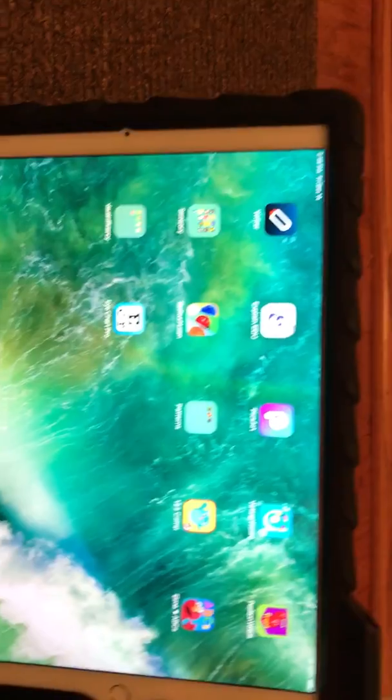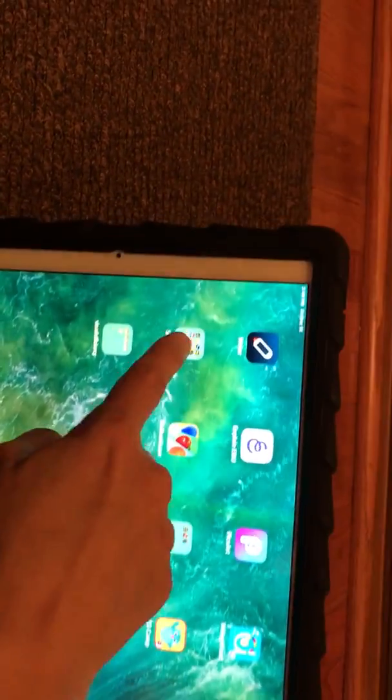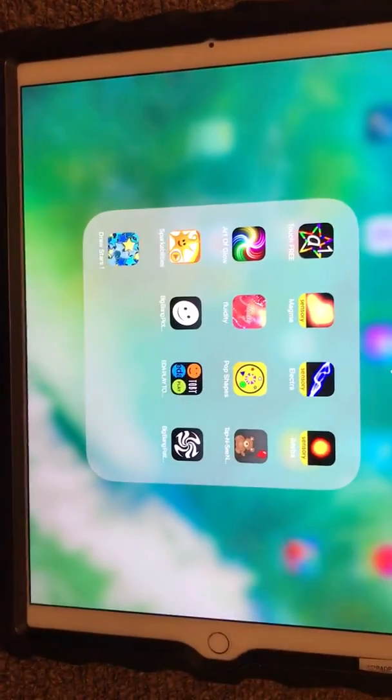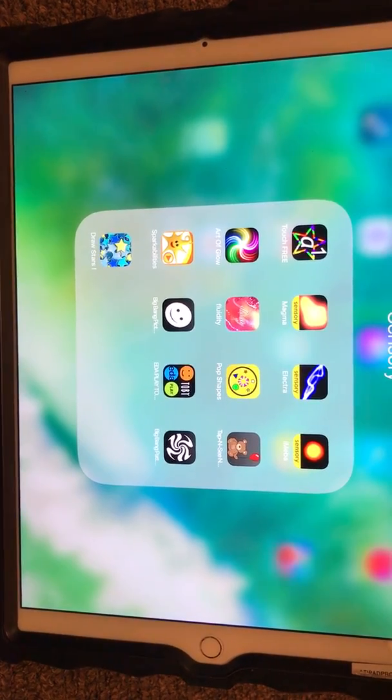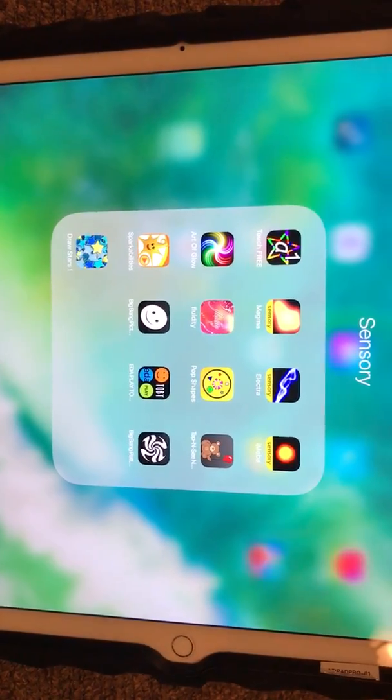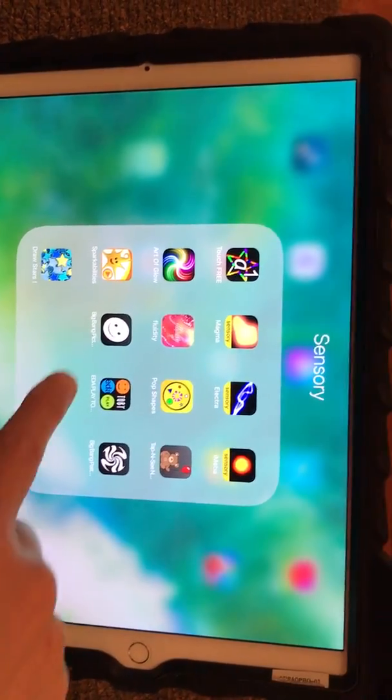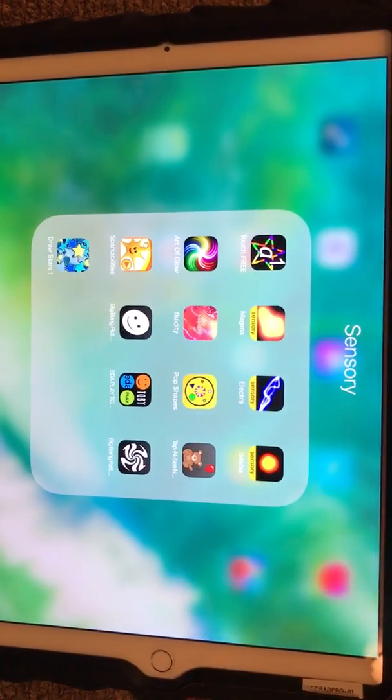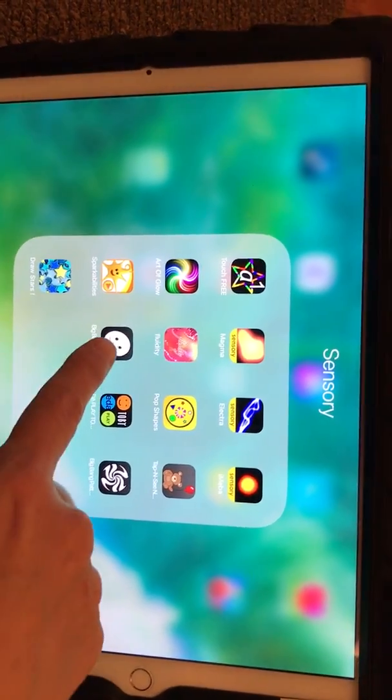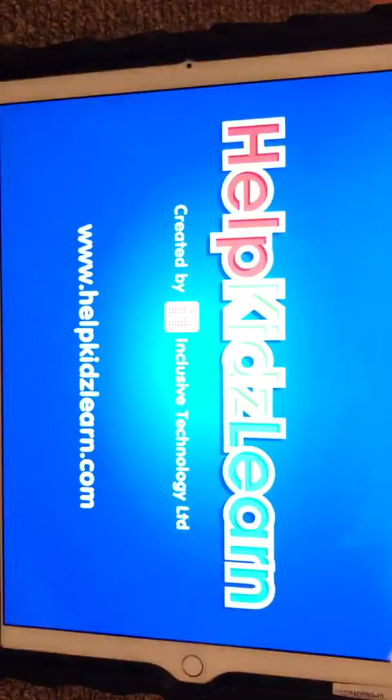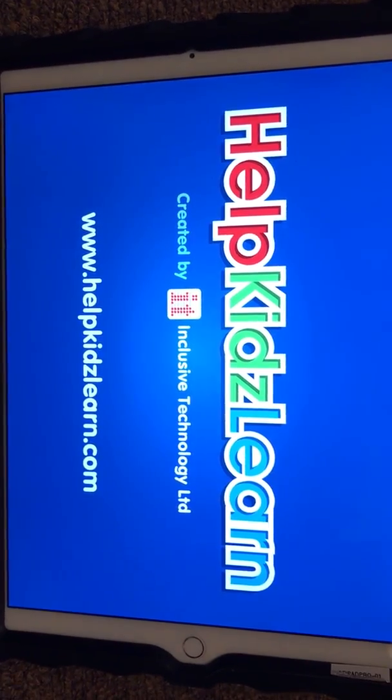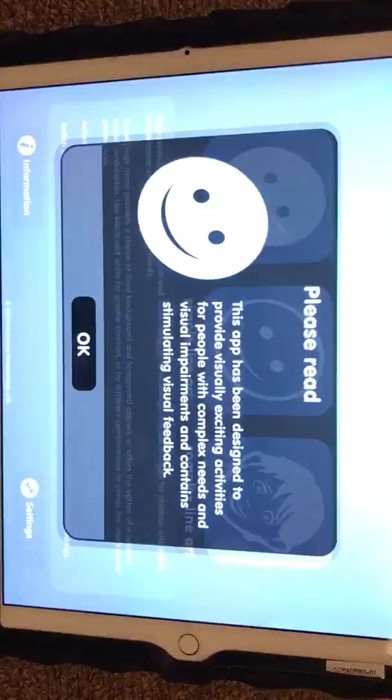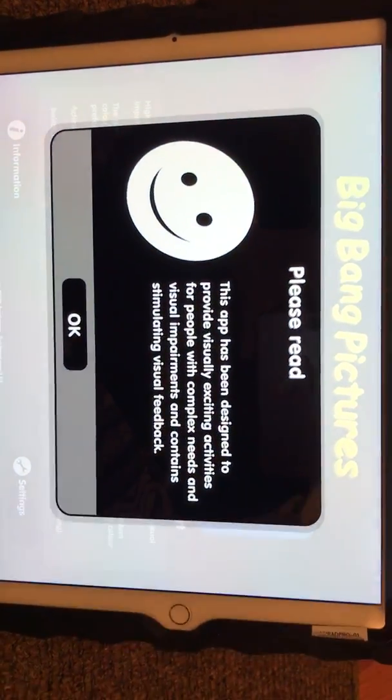I have them in my Sensory folder. The two that I've been using that I really like for students with cortical vision impairment are called Big Bang Pictures and Big Bang Patterns. Big Bang Pictures we'll take a look at first. It pops up and every time you use this, you'll have to activate the switch, so you click OK.